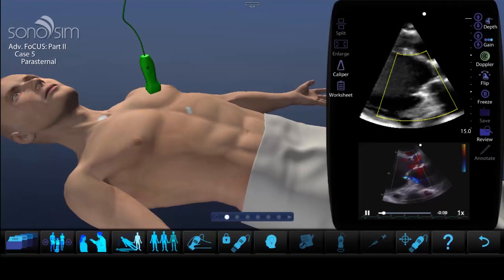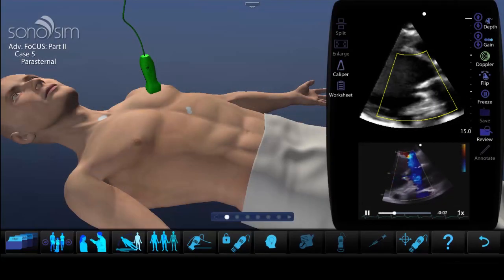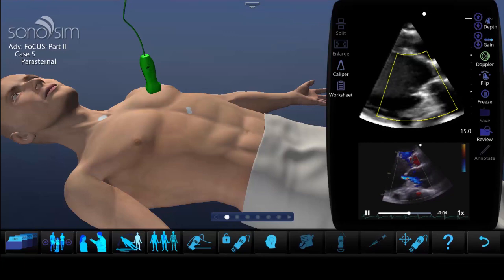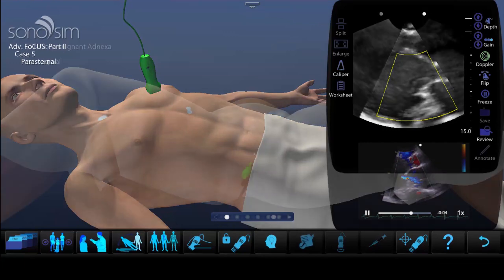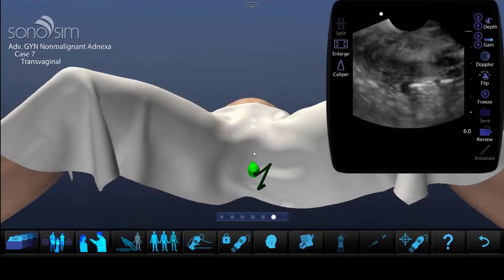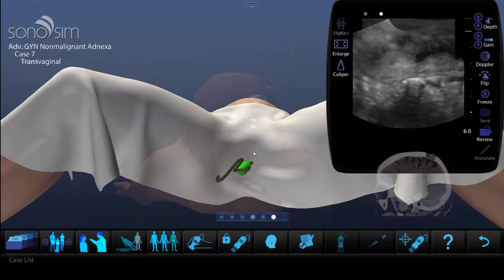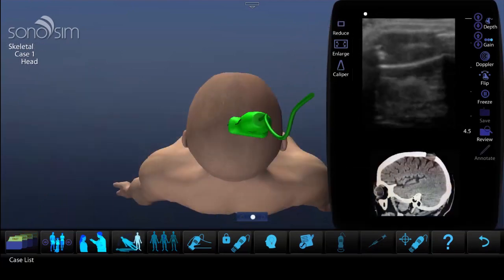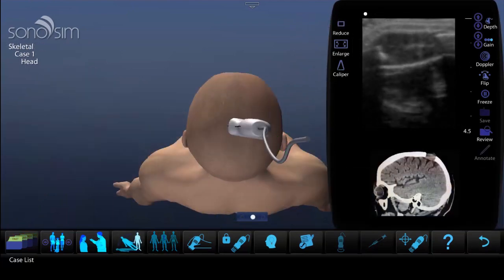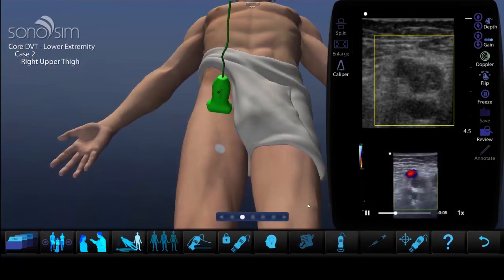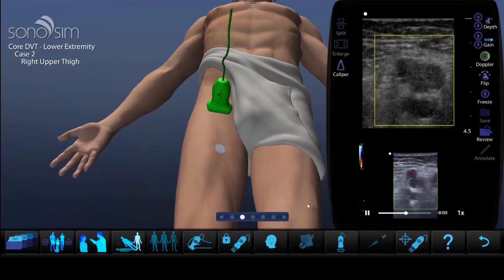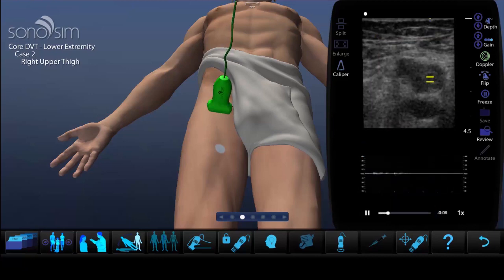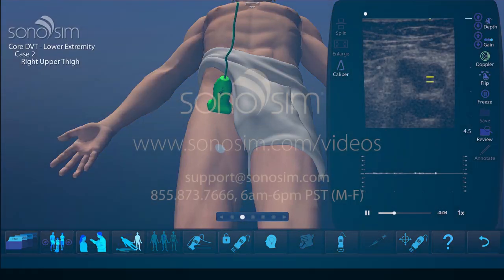With the Sonosimulator, enjoy scanning hundreds of on-demand patients and pathologies, including mitral valve regurgitation, antiverted uterine didelphys, osteolytic lesion of the skull, lower extremity DVT, and many more. Happy scanning!